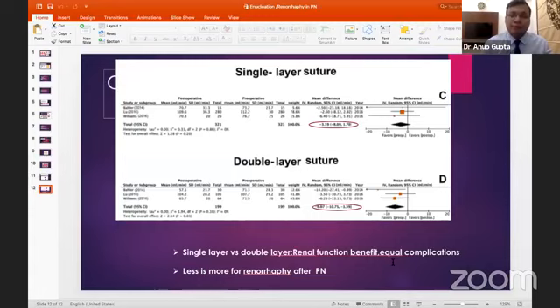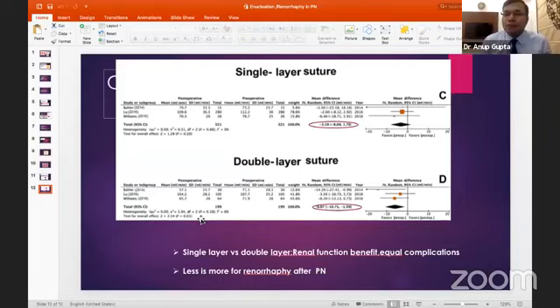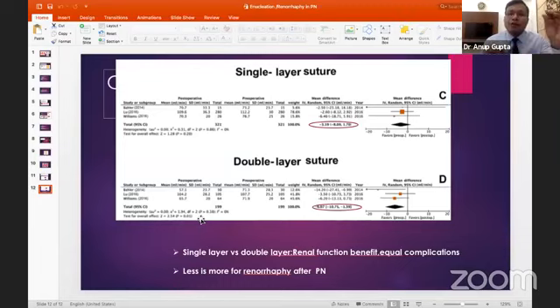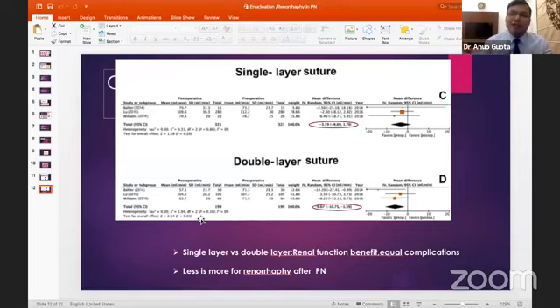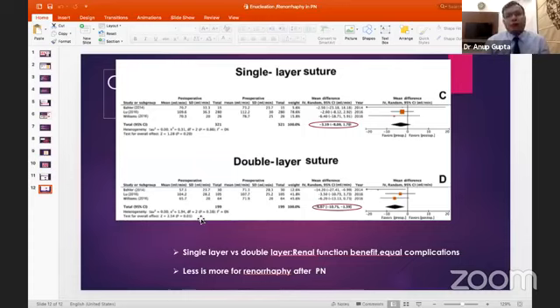Dr. Anup explains his indications for double-layer suturing: he uses it for large corticomedullary tumors where significant bleeding is expected, taking the inner layer first then closing the capsule over it. For small cortical T1a tumors, a single layer suffices. For central hilar tumors where no outer capsule exists, a modified two-layer approach is used at the poles while leaving the center open.